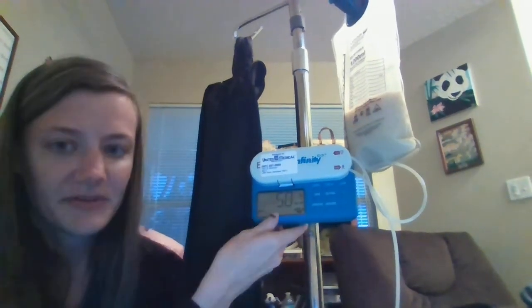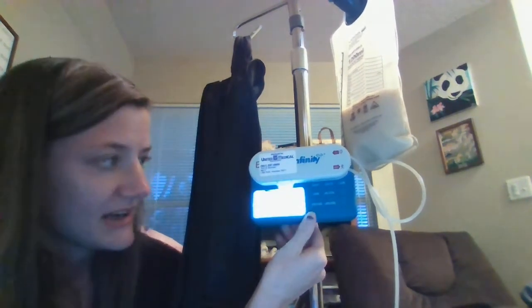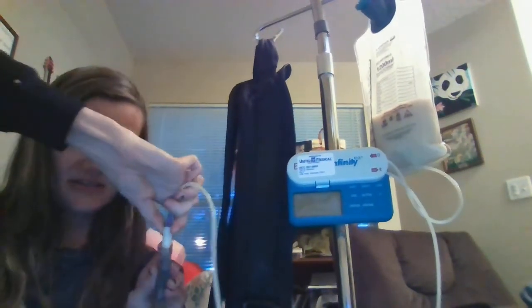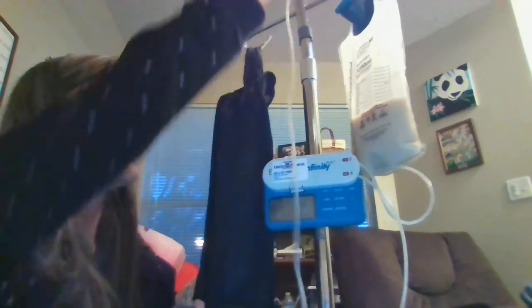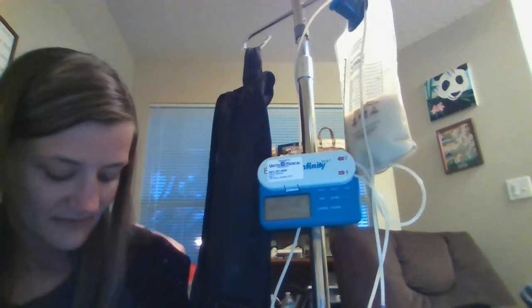And now to turn off the machine, you press this button right here, which is the run/pause button. And then if you want to turn it off, you hold the on-off switch and it will power off. And then you remove this thing. All you do is twist it, close this. This is the most important thing. You must close this or you will lose a ton of digestive fluid that can be extremely dangerous and dehydrate you. It's very bad. So make sure you close this, not to mention it will leak everywhere and stain. It's fully closed, yeah.